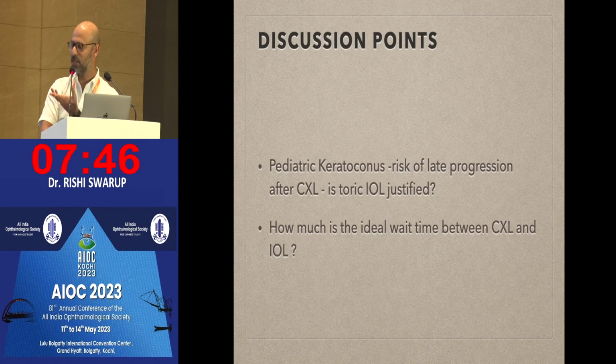Yeah. For my pterygium cases, I think 3 months minimum you must wait. I've seen that till 3 months the topography tends to change. And after that, it's a good idea to repeat two topographies and see if there's stability and go ahead. So I think that's good enough.